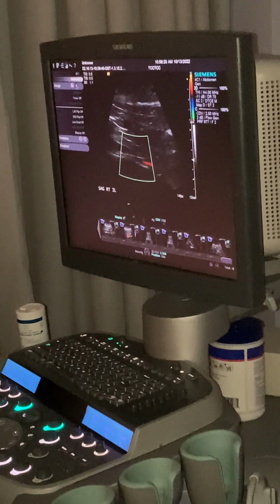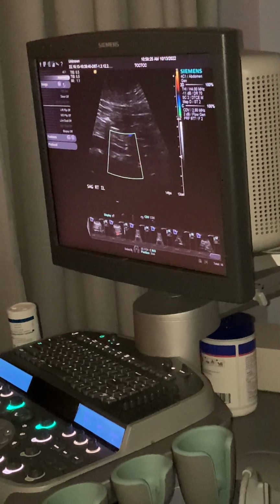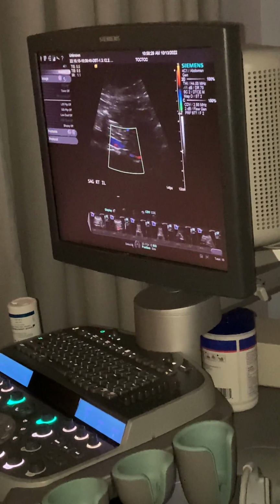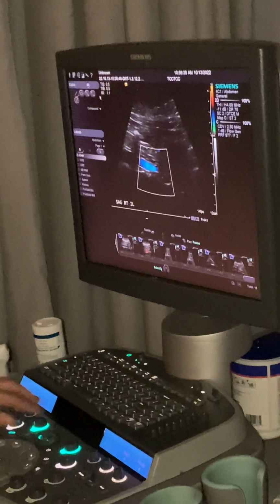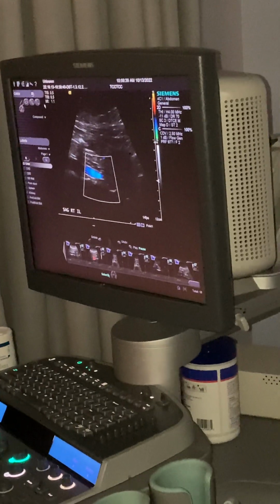Are you measuring the right and the left, or the bifurcation for the color? I'm at the right iliac. I didn't measure the color, I measured the AP, and now we're putting color on it, to take a picture. So you'll need sagittal color with it as well.